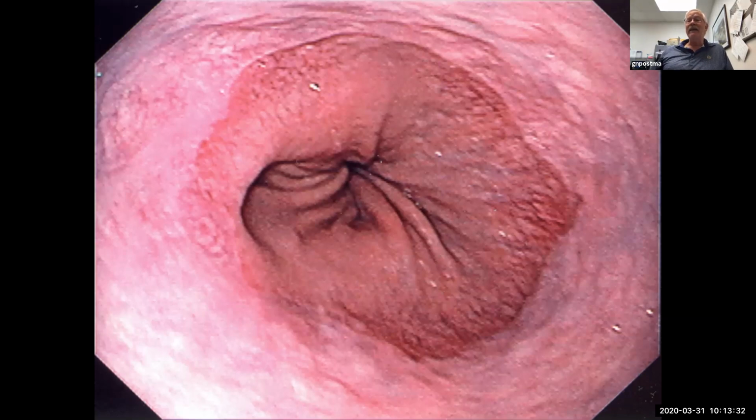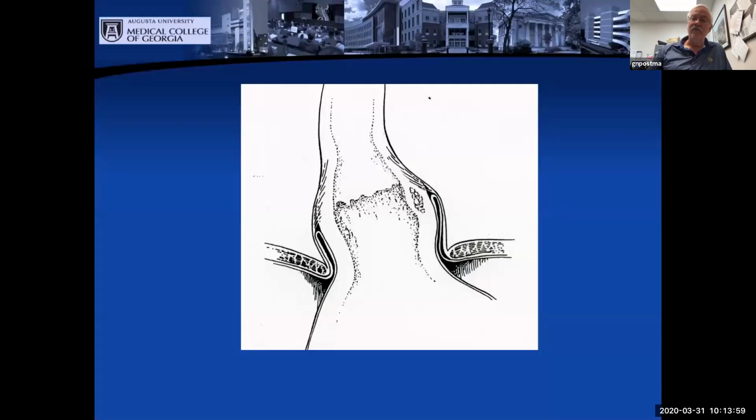And sampling error has been demonstrated in the literature to be a real problem in people with Barrett's. In other words, you can get a negative biopsy here, negative, Barrett's, in situ adenocarcinoma, that type of thing. Because sampling error is so real, biopsies done with the large therapeutic scope, I think, are the actual proper standard of care, in my personal opinion. So I send people with clinical Barrett's to my gastroenterologist and GI colleagues.